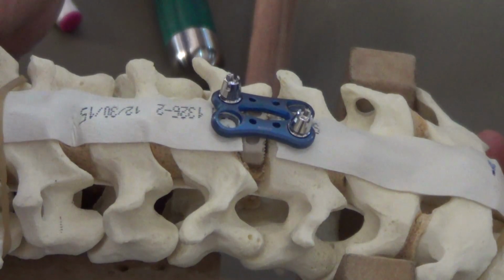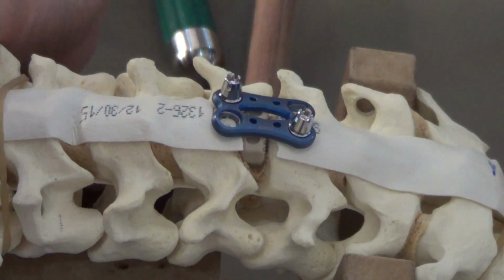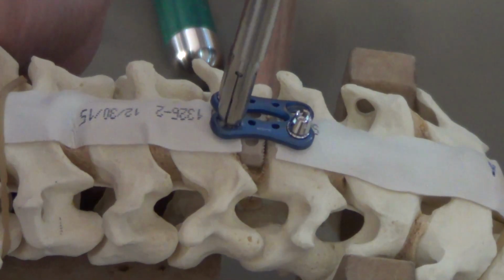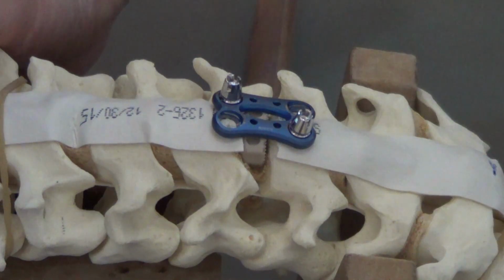So the size of the screw that you are using, just use it. Or in fact, I usually use it even less, about 14 millimeters, so that the screw itself, the next 2 millimeters will find the purchase. So if you have the old set, you just drill it in the direction that is in the bone. So after drilling it, then you can put the screw.